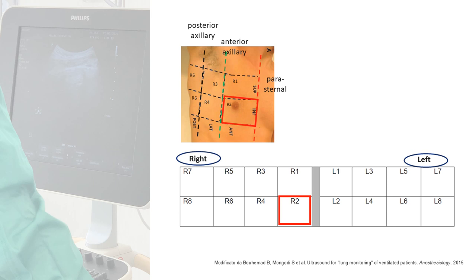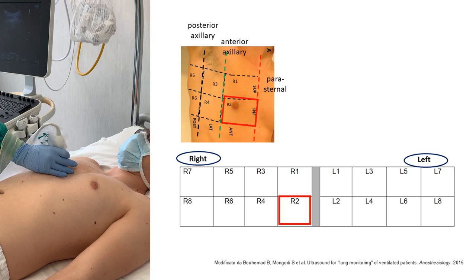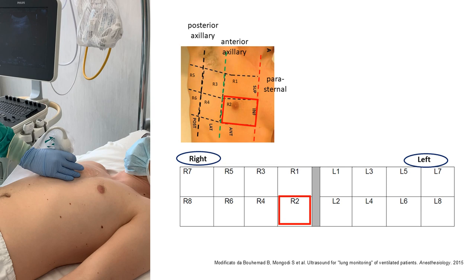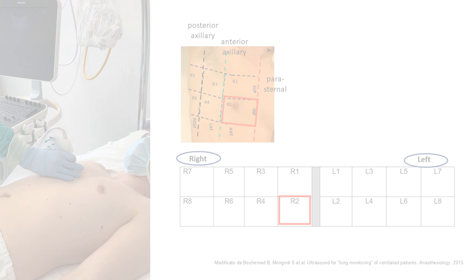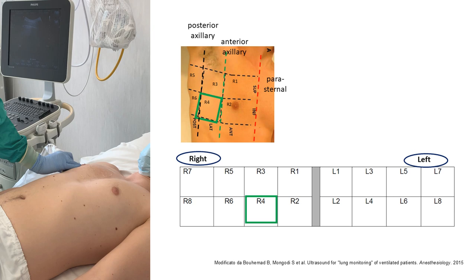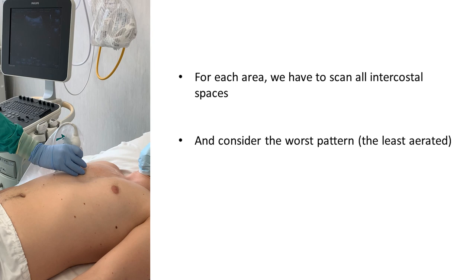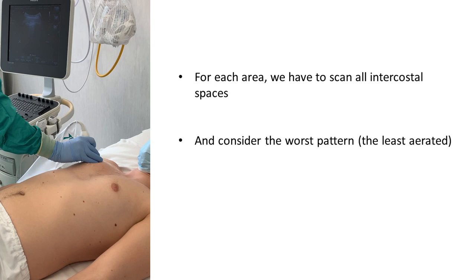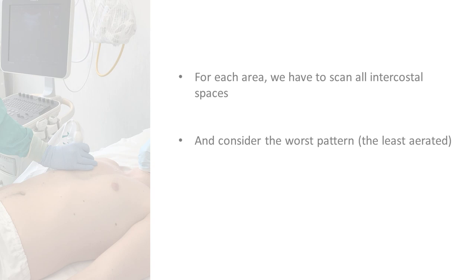We then move to the right anterior thorax lower part. If we record a clip, it should last at least a full respiratory cycle, possibly 5 to 6 seconds. Let's go on to the right lateral thorax, first the upper part and then the lower part. For each area, it is advisable to scan all intercostal spaces, considering the worst pattern — that is, the least aerated one.